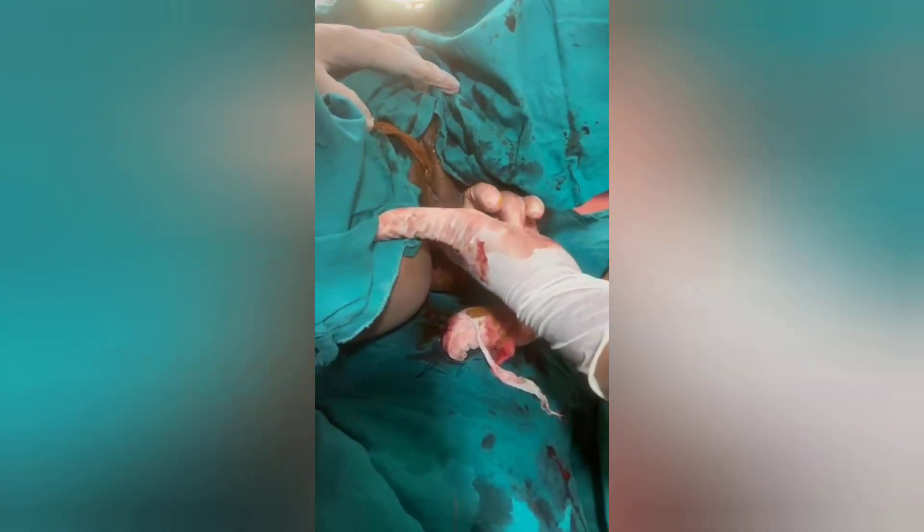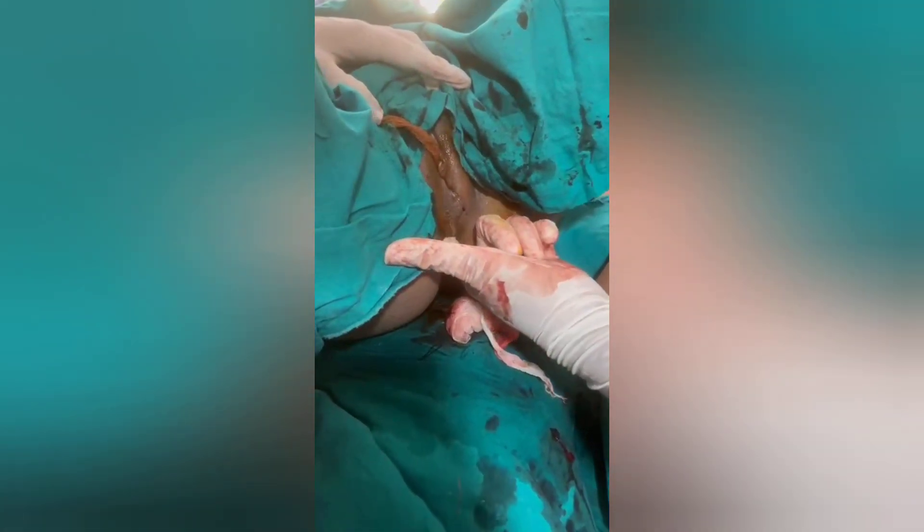At the end, perform a per-rectal examination to assess if any stitch has gone accidentally into the anal mucosa. This PR examination is done both at the beginning of the epithelium suturing and at the end — at the beginning to check for any involvement of the anal epithelium, and at the end to check whether any suture has accidentally passed through the anal epithelium.